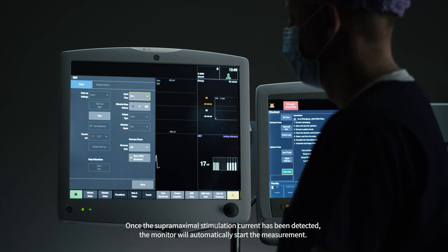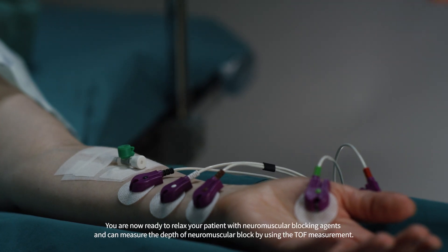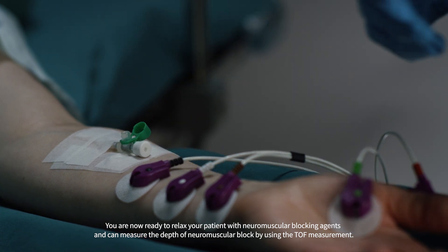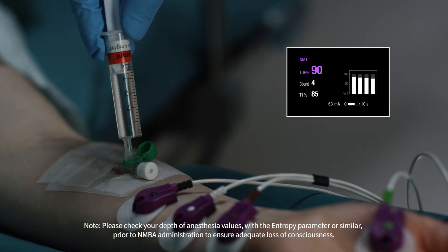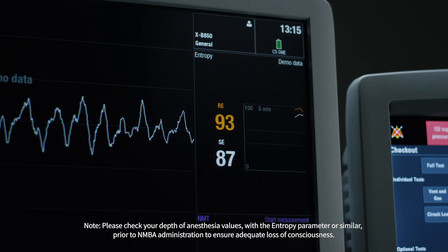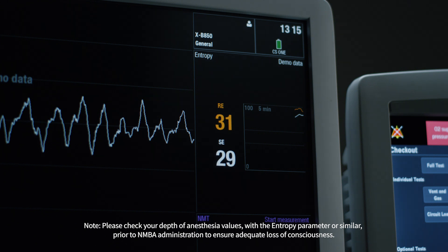Once the SupraMaximal stimulation current has been detected, the monitor will automatically start the measurement. You are now ready to relax your patient with neuromuscular blocking agents and can measure the depth of neuromuscular block using the TOF measurement. Note: please check your depth of anesthesia values with the entropy parameter or similar prior to neuromuscular blocking agent administration to ensure adequate loss of consciousness.